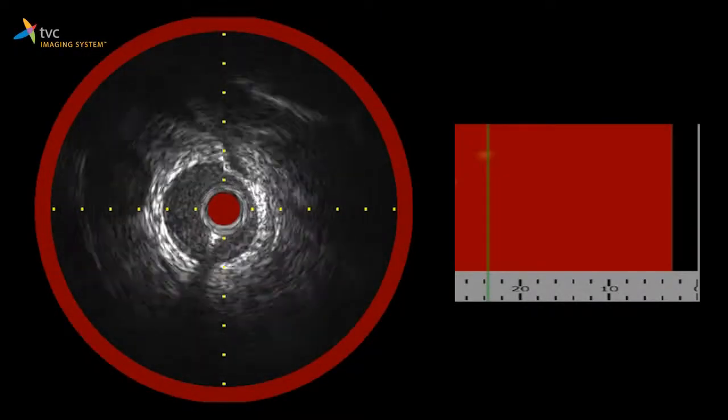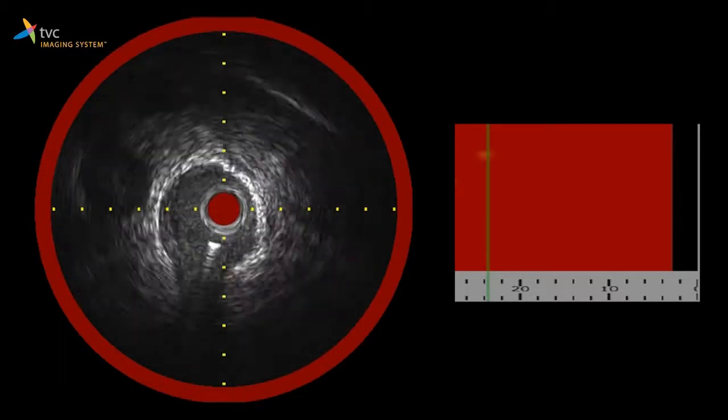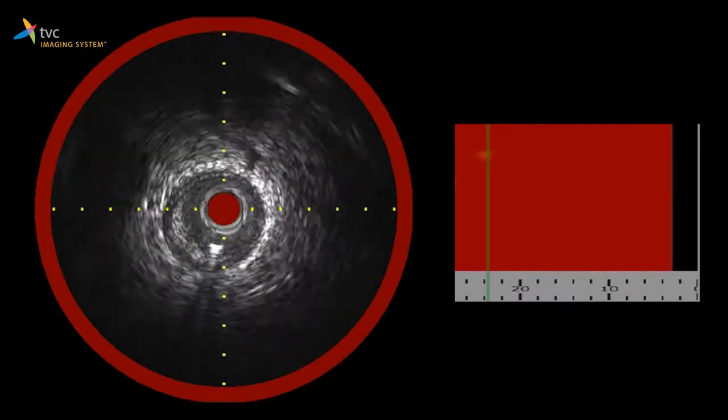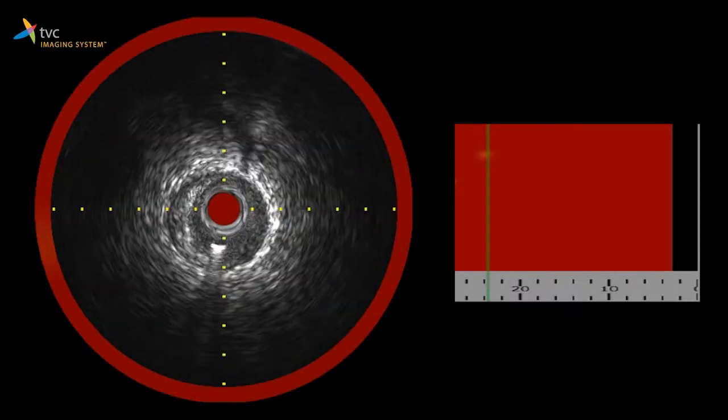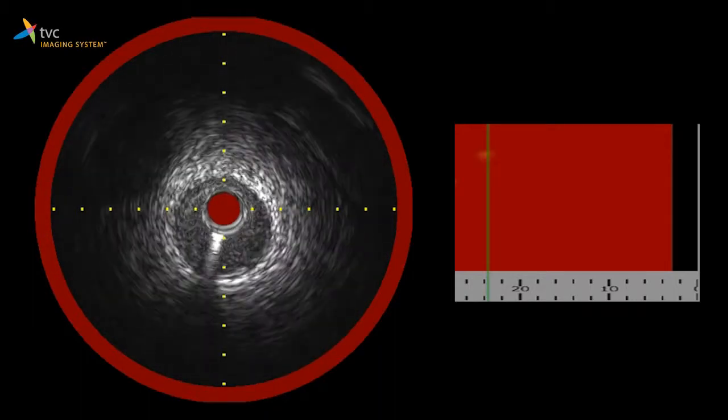I actually was pretty surprised to not see any lipid core plaque. The TVC imaging showed no ruptured plaque and actually only a modest amount of plaque burden and no yellow whatsoever. There was none of the lipid core plaque that I expected to see. So with the combination of two negative findings for a culprit lesion in ST elevation MI, I decided that this probably wasn't the culprit lesion and therefore a stent wasn't warranted.